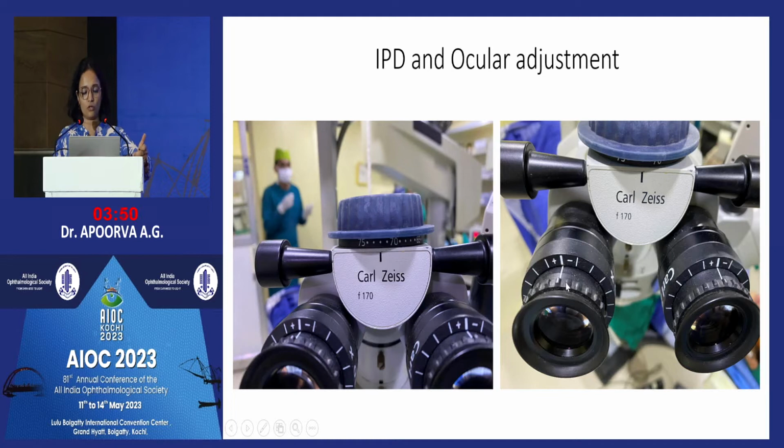People who do not want to wear their prescription glasses, with exclusive spherical error, can use it from -8 to +5. And when we have the fusion of the two images from our eyepieces into one, that's when we measure our IPD on the measurement ring. And like I said, this can be a little variable in the beginning of our career.